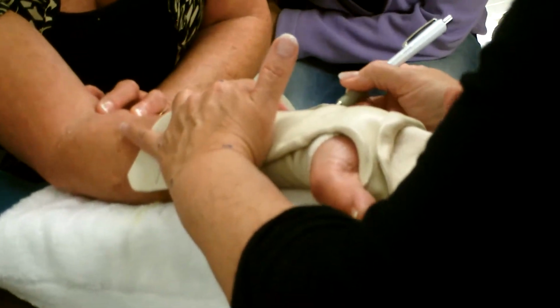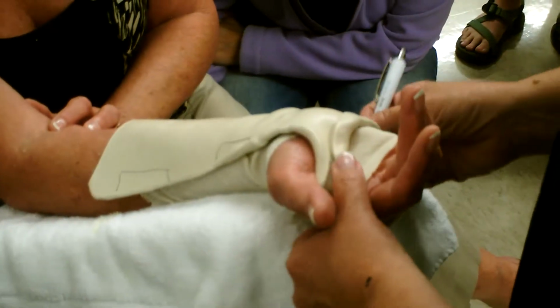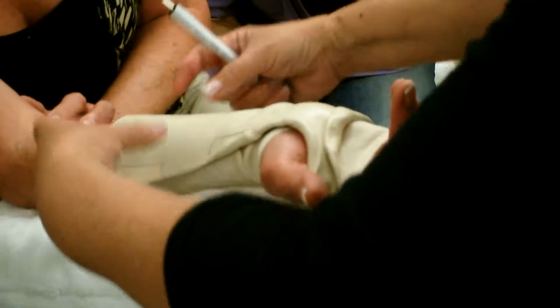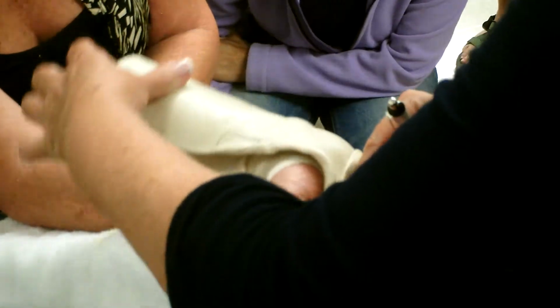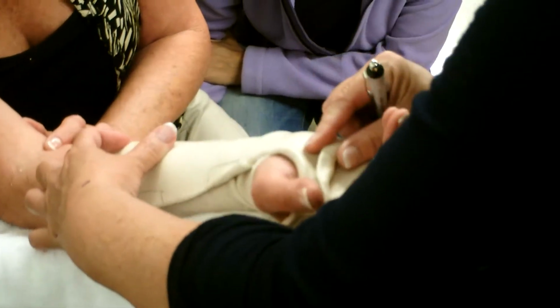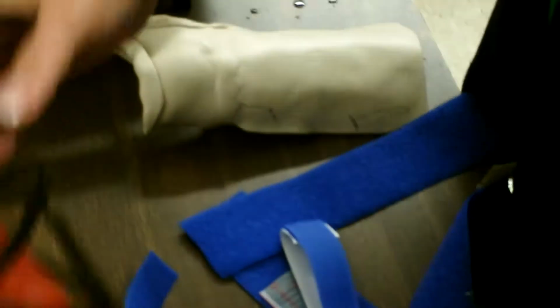Okay, so we're going to need a 1-inch strap here, 2-inch, and 2-inch. If we didn't have good strapping, the splint is going to tip this way or tip this way. So we've got to have good straps. So I mark here, and then I mark here. Now, the next step is, I've got this nice Velcro here, and if you'll plug this in.